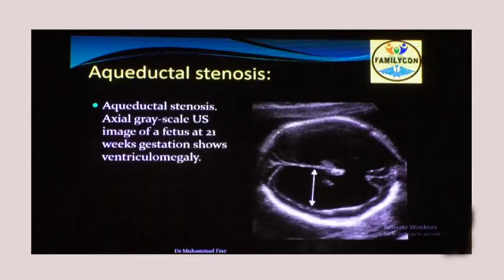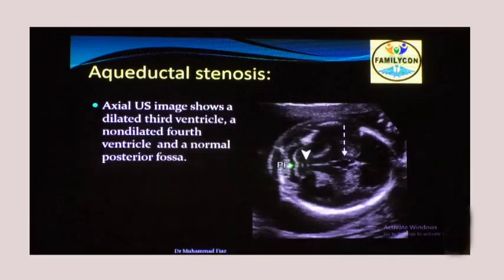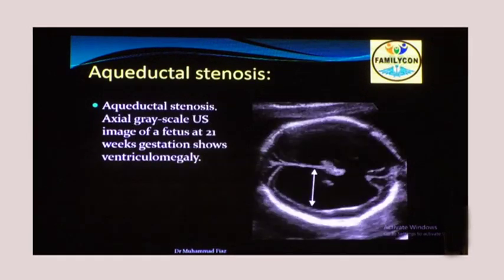This case shows gross ventriculomegaly, but on further images the fourth ventricle was collapsed — this was a case of aqueduct stenosis. The fourth ventricle is hardly visible, the third ventricle is also dilated, and the lateral ventricles were dilated. This is a typical case of aqueduct stenosis.